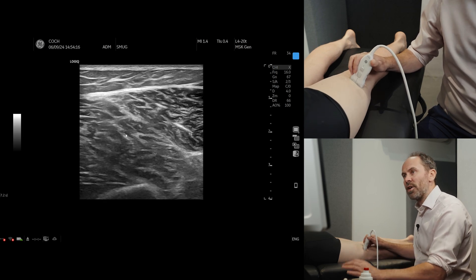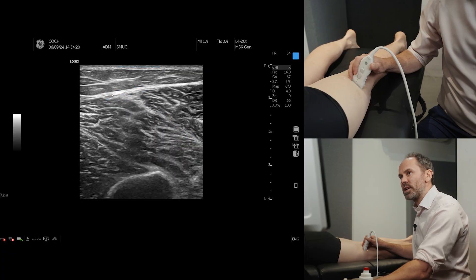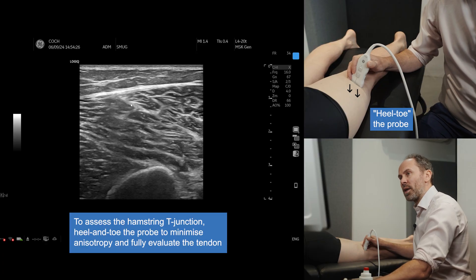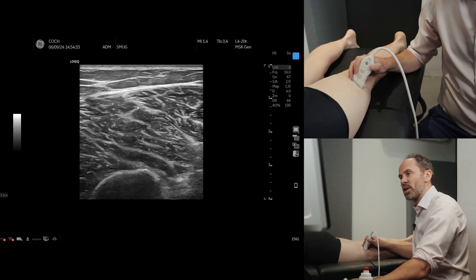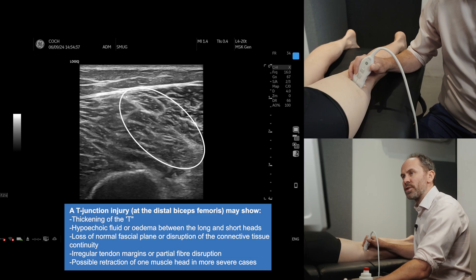Now the T-junction area where you get lots of tears is this region here, and you can see a T. If I just heel the probe down or toe the probe down, I will be able to get the fascial plane slightly more parallel and you can see it. This is the bottom of the T, this is the top of the T — the T-junction between short head and long head, and this is where we need to look for our injuries.